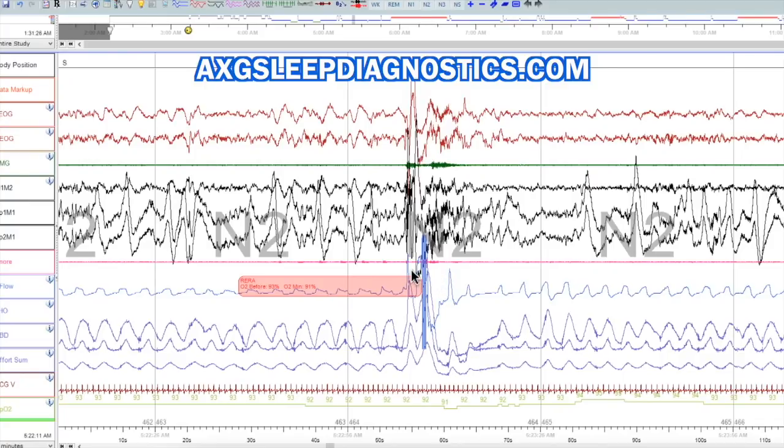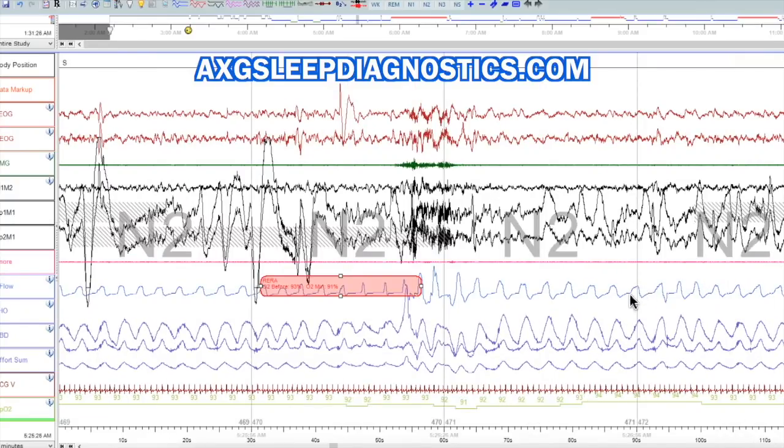So when you're looking at your SleepyHead data, you see jagginess, a jagged wave, think to yourself, probably woke up here. And then especially if it goes back to being uniform and nice and smooth like this. Okay, here's another example, showing the same thing, a little bit easier to see. You see how it's real jagged here? Almost always that is indicative of an arousal, and you can see that through this EEG.